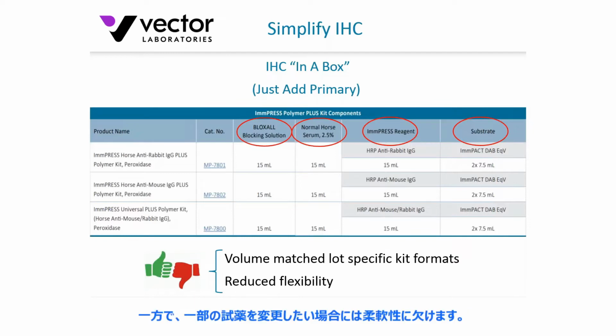But unfortunately, it does reduce the flexibility of the detection methodology if you're going to change out some component, or at least look to change out a component. But nonetheless, these are a great segue into immunohistochemistry.